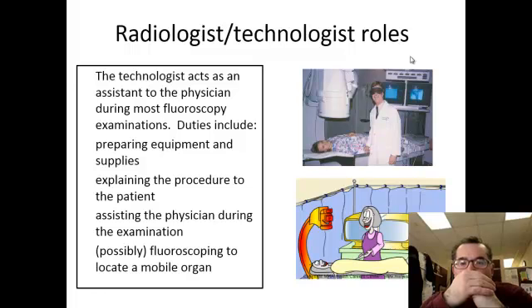We'll talk later on about how this process has switched from a conventional type of fluoroscopy, which I've been describing, to more of a digital type of fluoroscopy, where images are captured in a digital format and there's no need for cassettes.